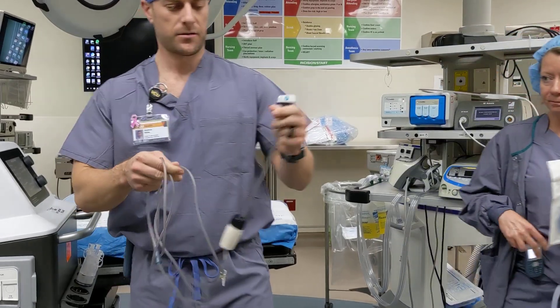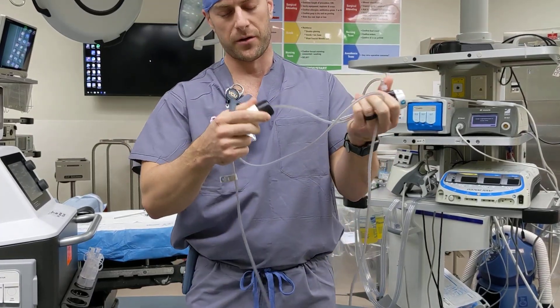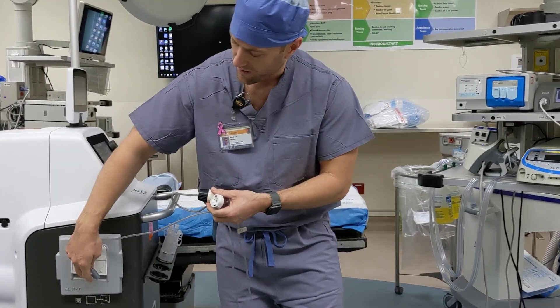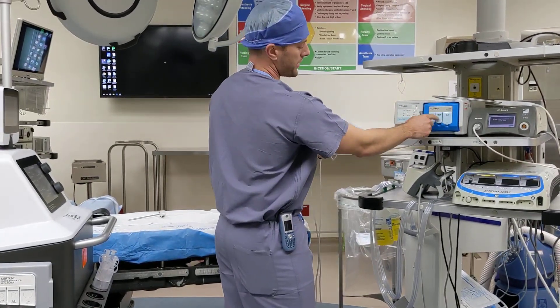You have two ends. One that's going to hook to your Trocar right here, and you have your other end — the blue end — with your ULPA filter in the middle. The blue end is going to either hook to your smoke evac port on your Neptune right here, the middle port, or the middle port on your ConMed smoke evac right here.